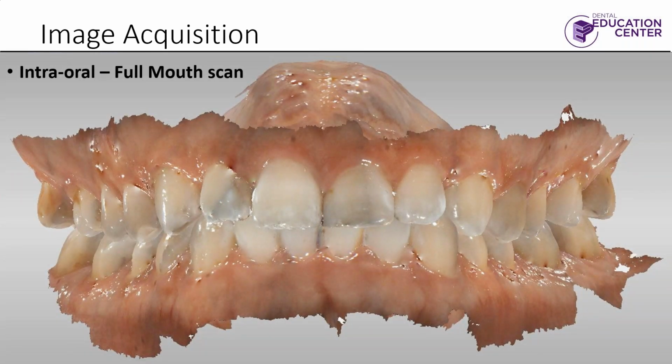Just real quick, going back to your point about the benefits as far as storage space and that sort of thing. One thing that you don't really think about is how often a patient comes in who's fractured a tooth and they have some kind of other appliance that they're wearing in their mouth. I had one not too long ago that the patient came in and fractured the palatal cusp off of one of his upper premolars, and he's wearing a sleep appliance. That's not a cheap appliance to remake for somebody if something doesn't fit.